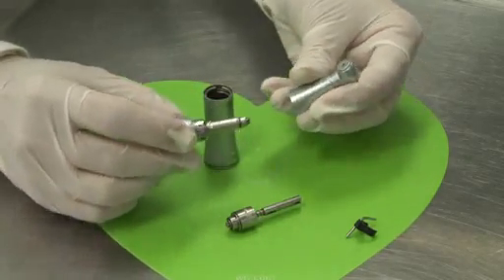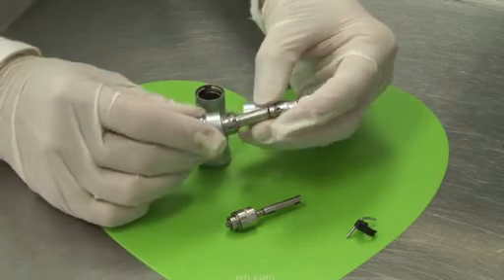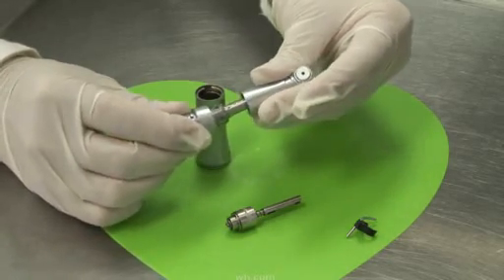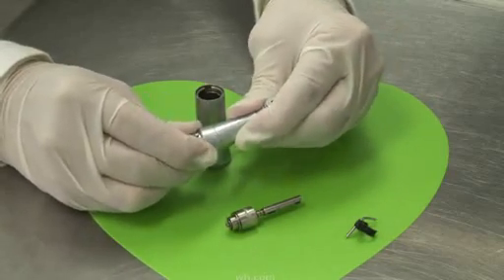Then taking the head gear assembly, align the push button hole to the notch, gently twist and lock into place.